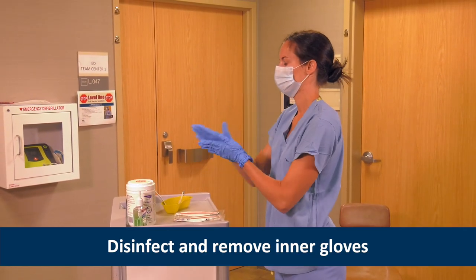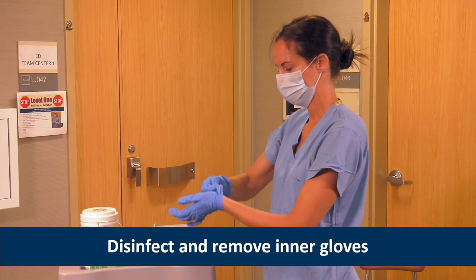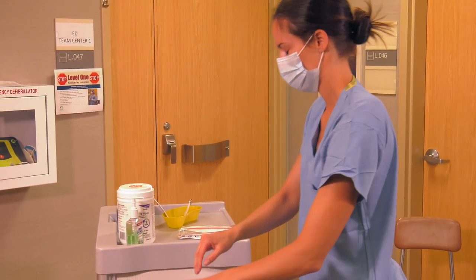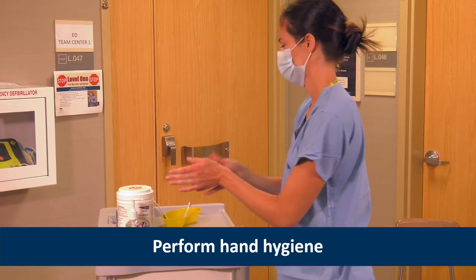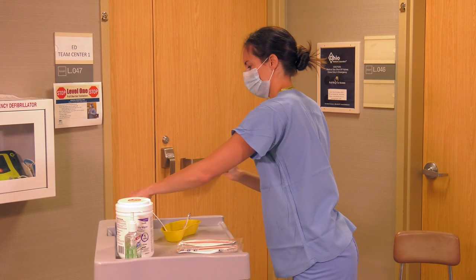Next, Heather disinfects and removes her inner gloves, taking care not to contaminate her bare hands during the removal process. Heather needs to perform hand hygiene on her bare hands before donning a new pair of gloves.